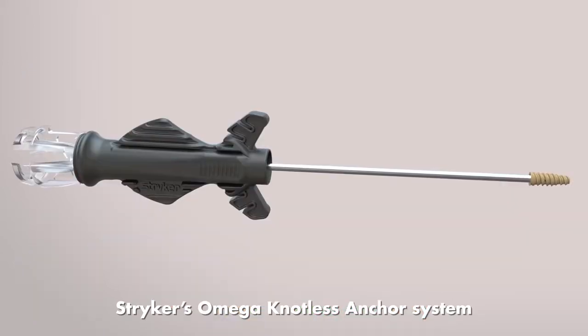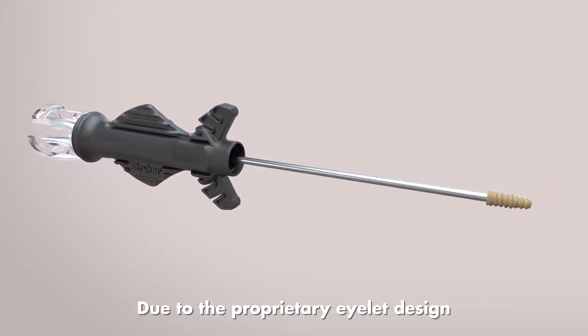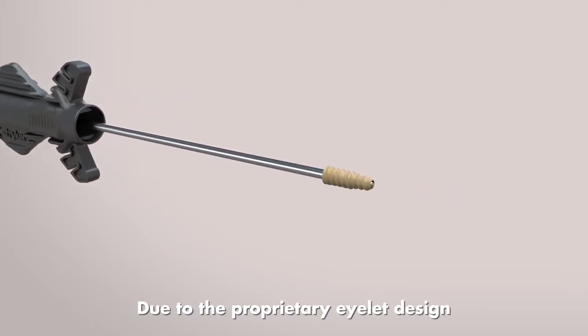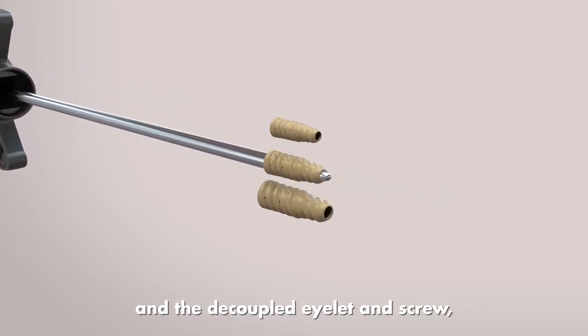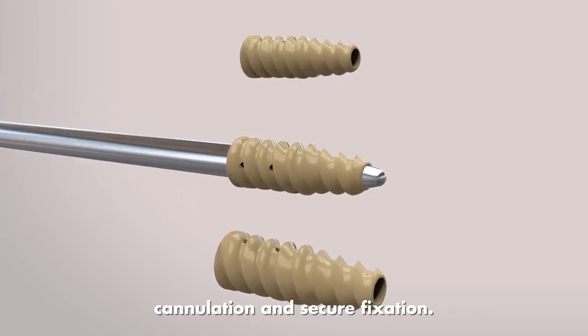Stryker's Omega Knotless Anchor System features an all-peak self-punching eyelet with screw and fixation. Due to the proprietary eyelet design and the decoupled eyelet and screw, Omega is designed to offer unobstructed cannulation and secure fixation.